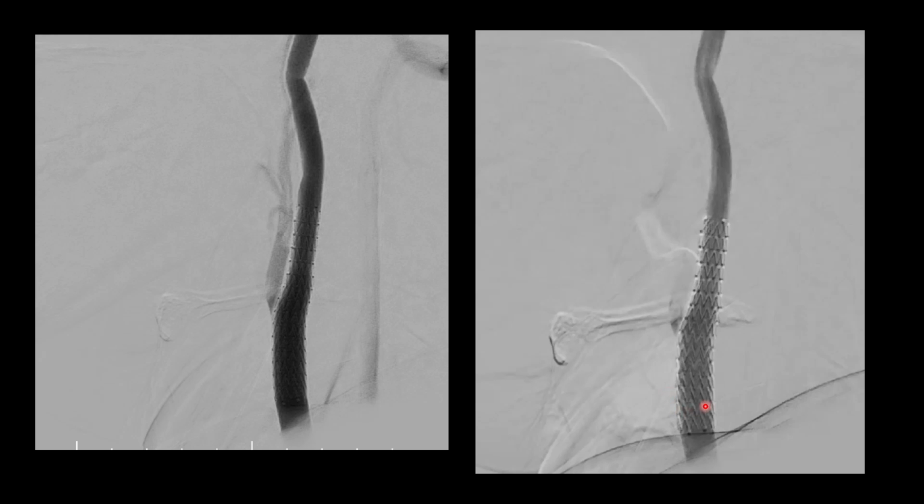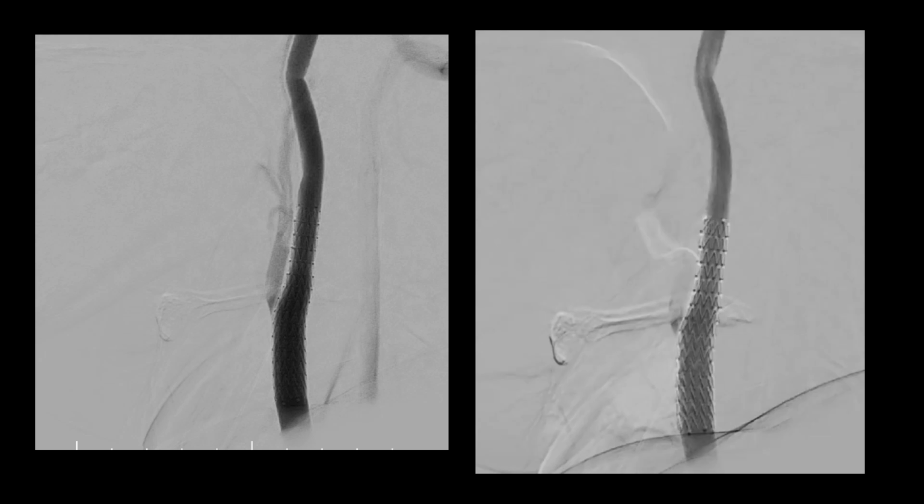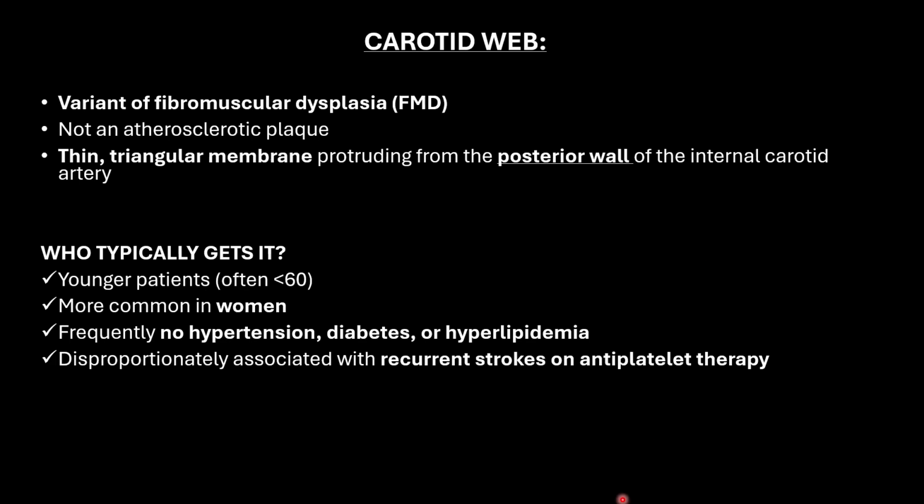So a stenting was done. These are the post stenting images. Here we are able to see the contrast is immediately getting washed off.